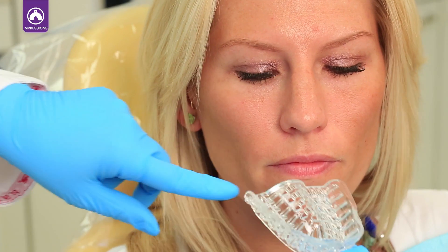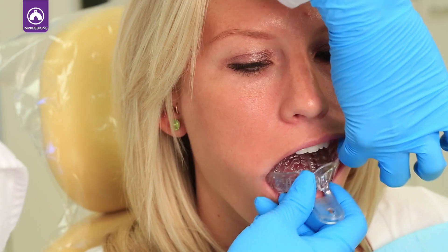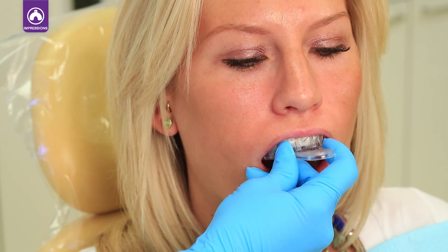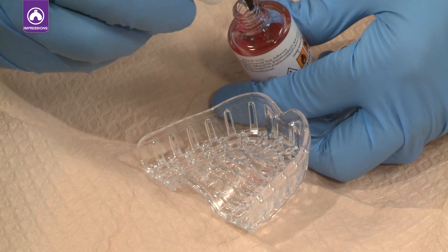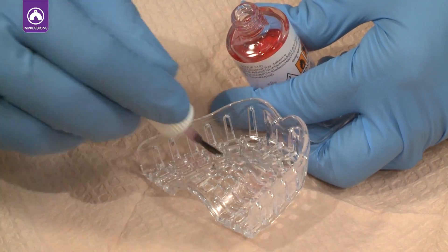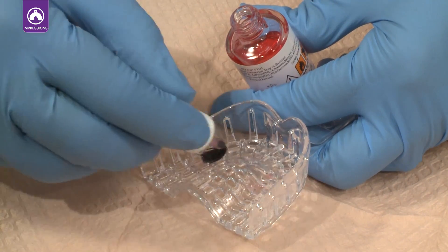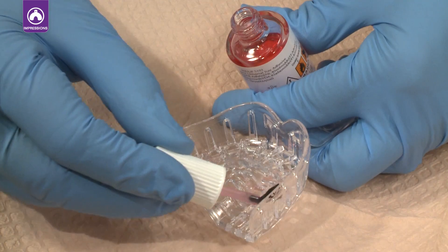Make sure that the tray is fitted to the patient before beginning the procedure. It should extend past the last molar and fully seat in the mouth. First, brush the tray adhesive onto the impression tray and wait until the adhesive is dry. The adhesive holds the impression material tightly to the tray, preventing the impression from distorting when removing the material from the tray.